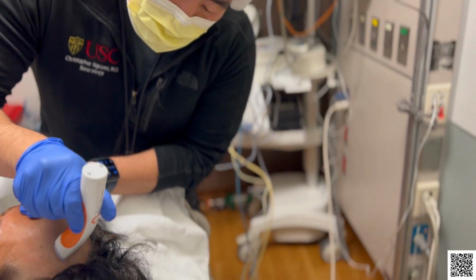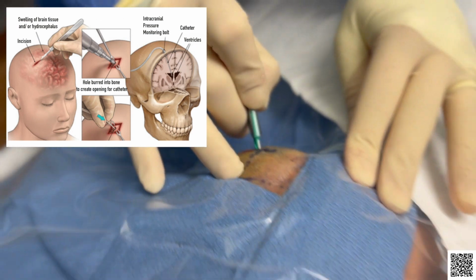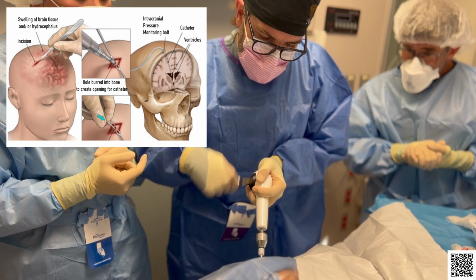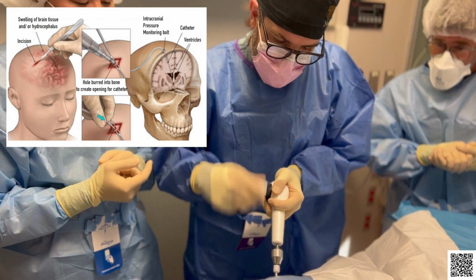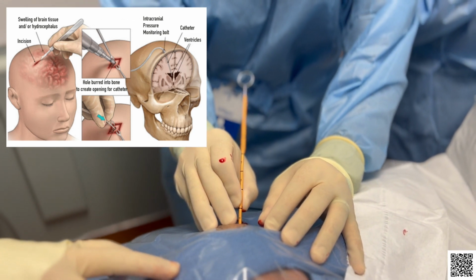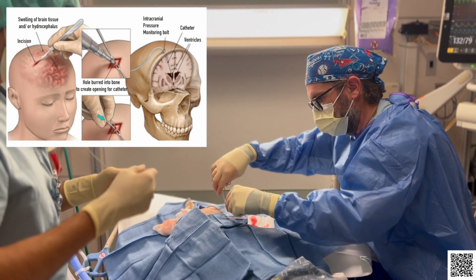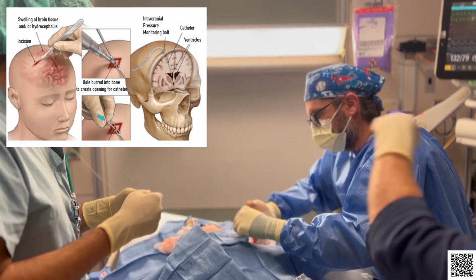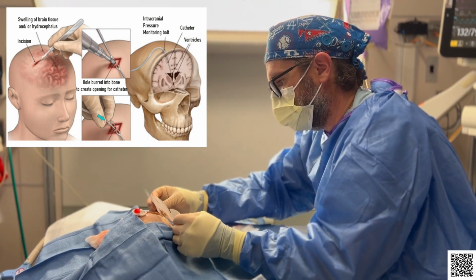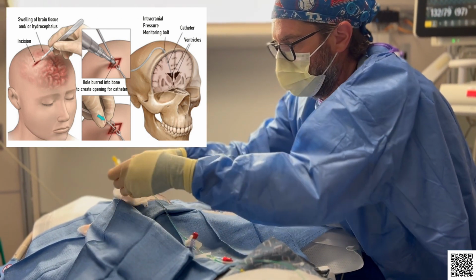The healthcare team will shave the hair on top of the person's head, and the surgeon will make a small incision into the skin. Using a surgical drill, the surgeon drills a small hole into the skull, and will then make an incision into the layers covering the brain. The surgeon then places a thin tube into the incision and through the brain. In some cases, the surgeon may use computer-assisted imaging to help the tube reach the right place within the ventricles of the brain. The surgeon will then suture the skin of the scalp to hold the tube in place, and a sterile dressing is placed over the incision and the stitch. Finally, the surgeon connects the tube to the pouch.